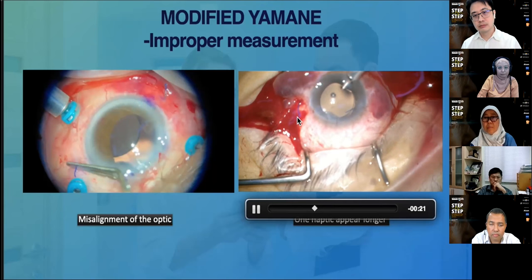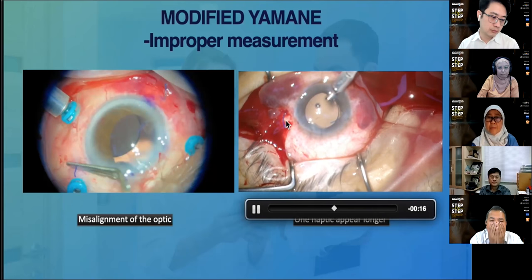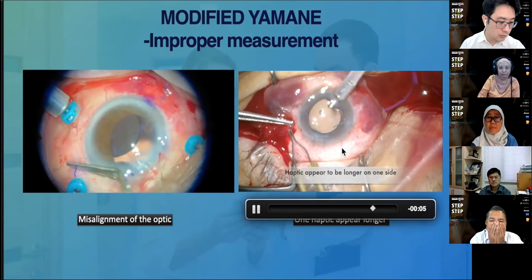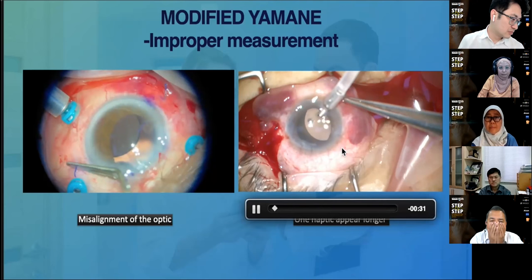So in this particular case, we have to cut off the tip of the haptic so that it is shortened a bit, just to get the optic centrally positioned. So sometimes some of these cases will end up in such a way. So at least we know what to do if we encounter those kinds of situations.